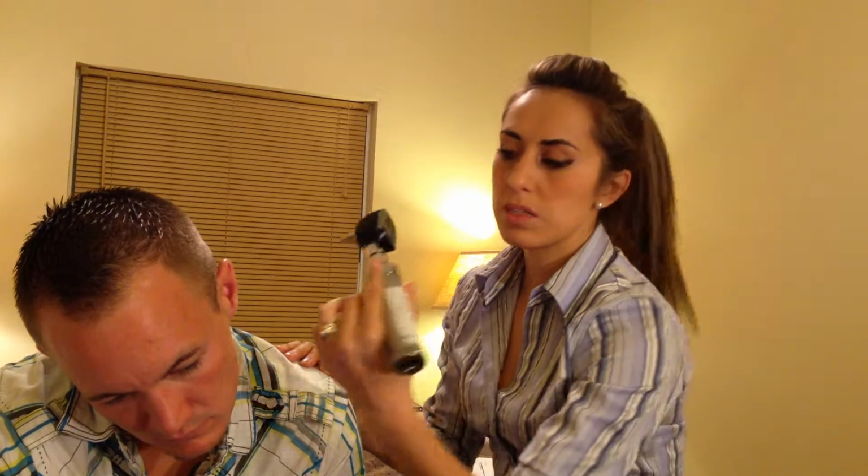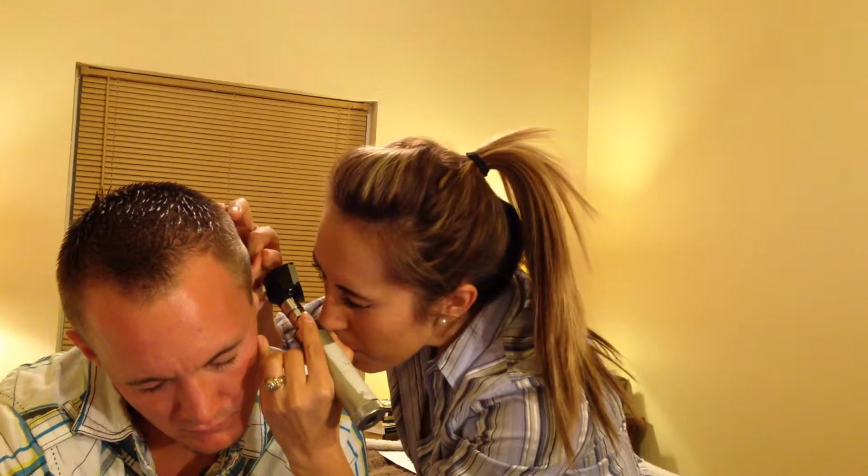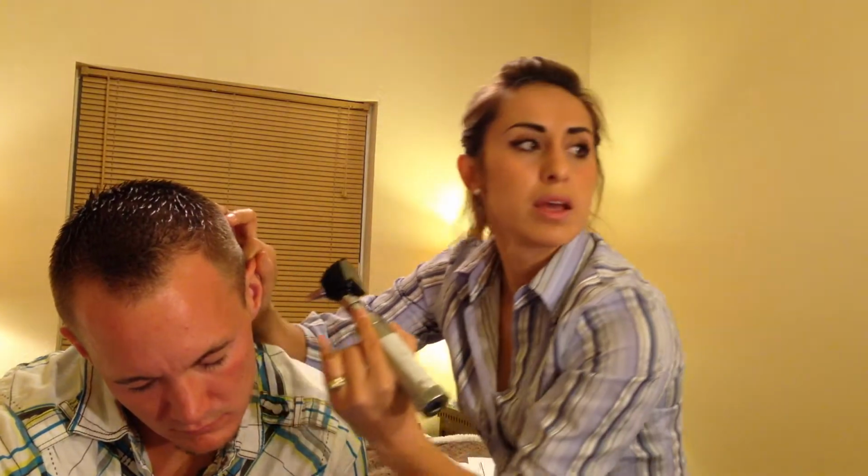So what we end up doing is resting the ulnar portion of our hand on the patient's head here, and then we use our other hand to pull the auricle up and toward you, so as to straighten out the auditory canal a little bit better, so we are better able to see the tympanic membrane and the meatus.